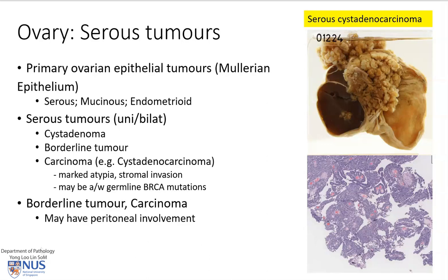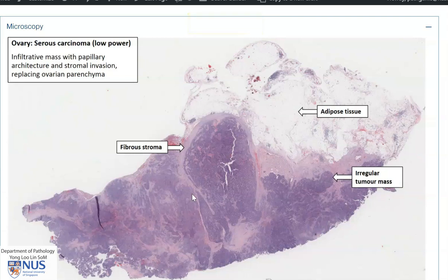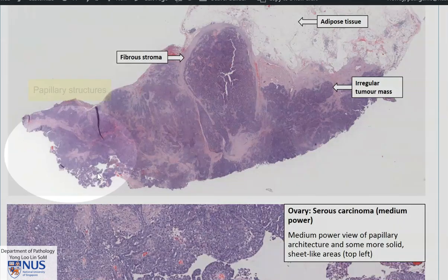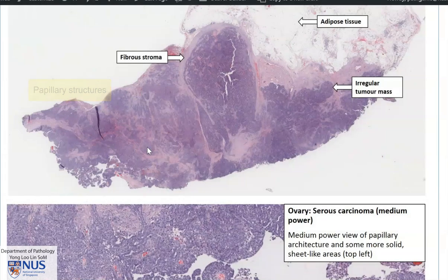Looking at the microscopic features more closely, here is a low magnification view. These pictures are taken from the PathWeb online pathology resource. We can see large blue areas signifying tumour that are clearly invading into the stroma, and at this end we can see some papillary structures protruding into the lumen of the cyst locules.